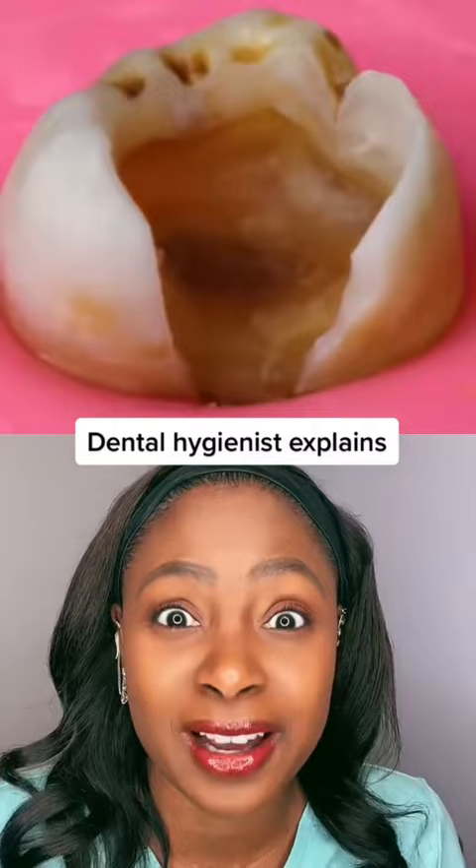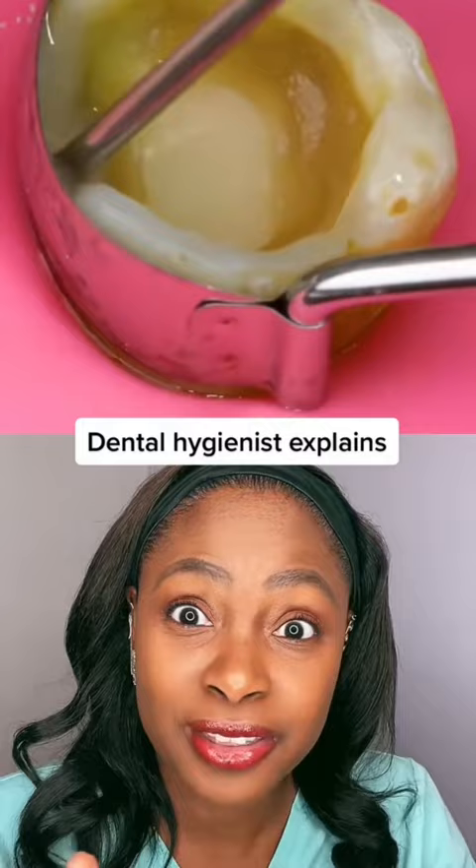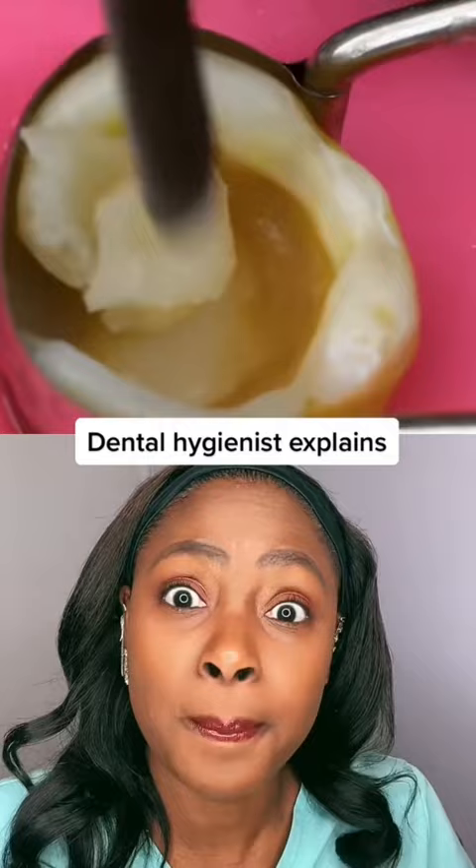The person's most likely numbed up so they're not going to feel any of this. They're putting a band over it. They're going to etch the tooth to clean it out even more and then they're going to bond the tooth. They're using flowable composite on there, light curing that, and then packable composite and they're just going to slowly build this tooth up.